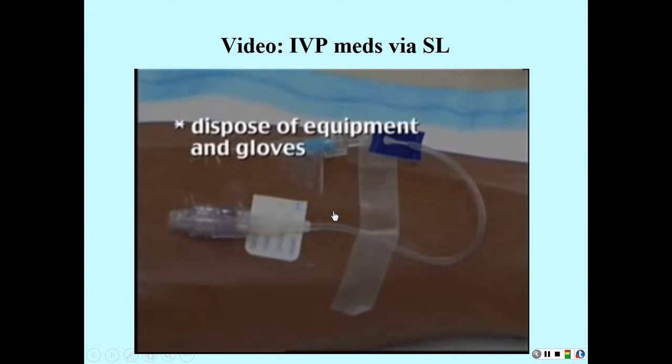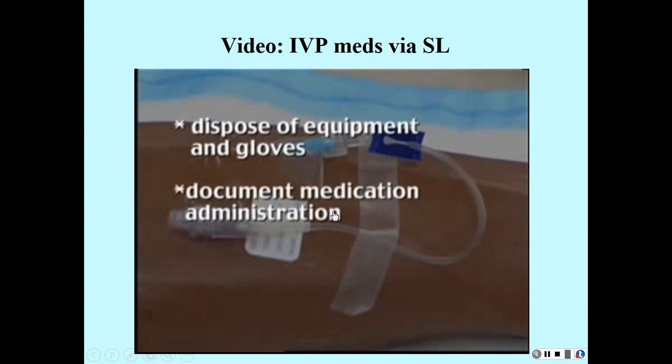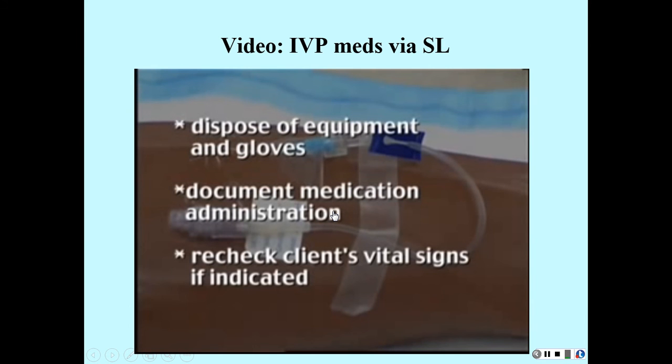Dispose of equipment and gloves. Document medication administration. Recheck client's vital signs if indicated.